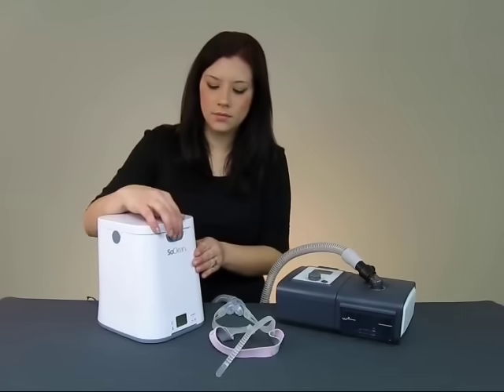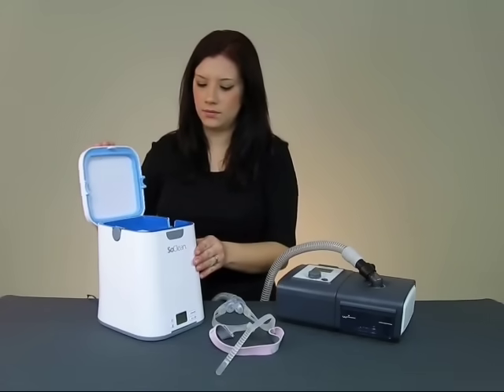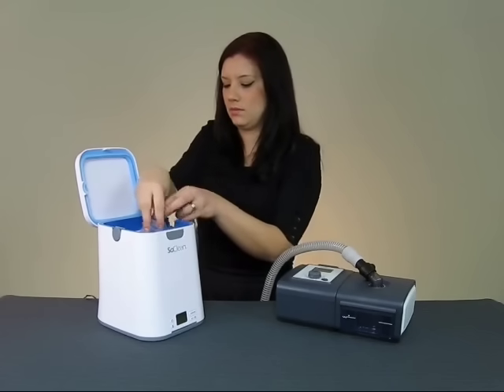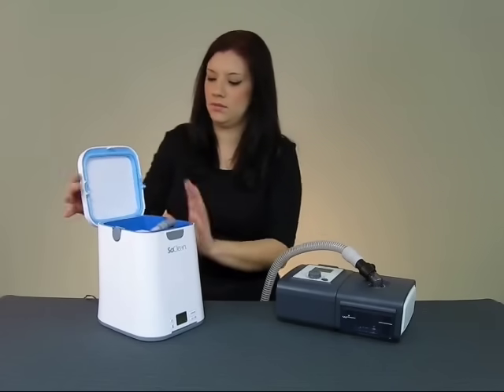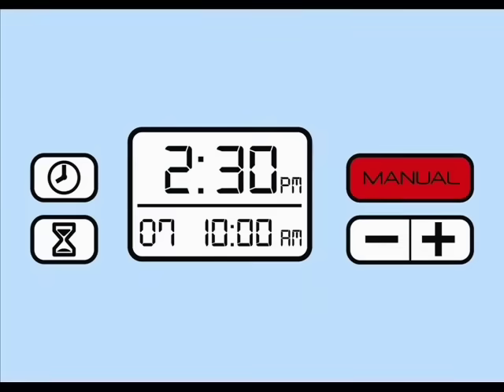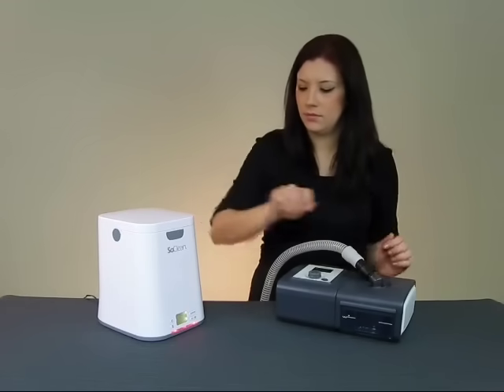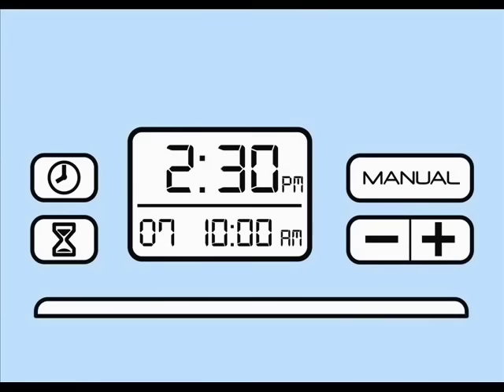For those times when you wish to sanitize your equipment apart from your scheduled cycle, simply place your mask inside the SoClean like you normally would and push the Manual button. The SoClean will then operate according to your preset run time. Your stored timer settings will not be affected. As you would during normal operation, wait for the green light before removing your equipment.